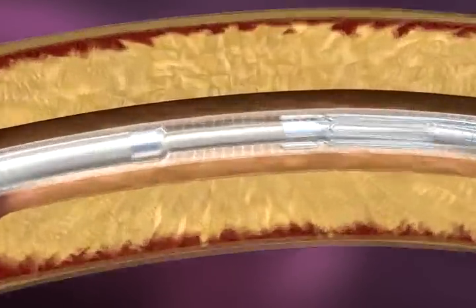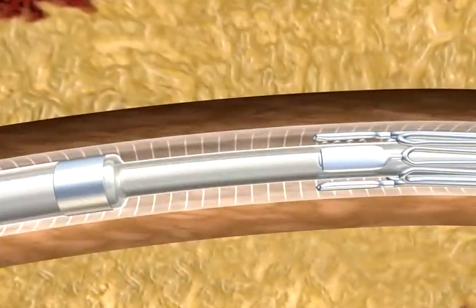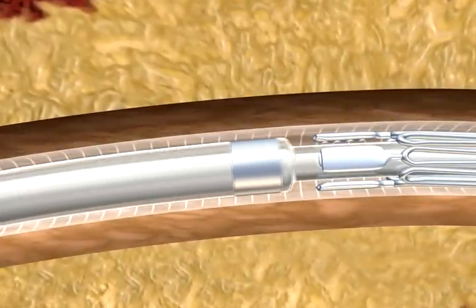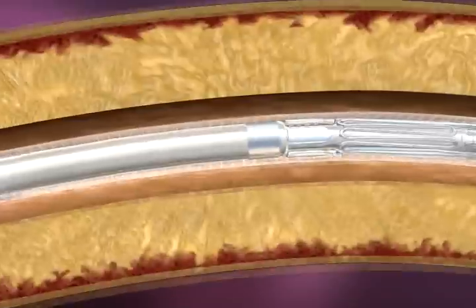Advance the inner body of the delivery system until the proximal marker band bumper is just proximal to the stent. This prepares the stent for deployment.